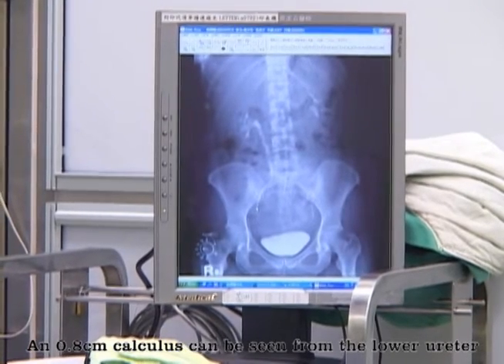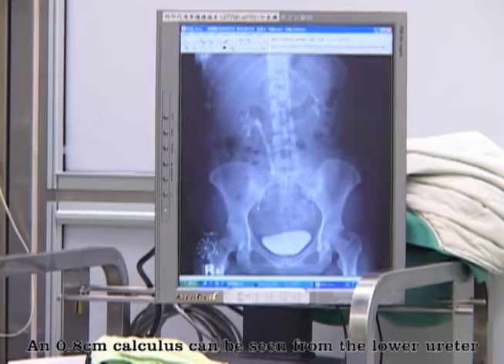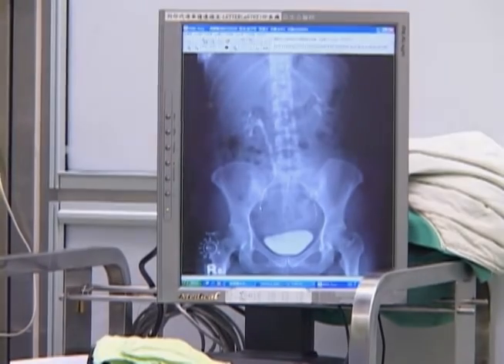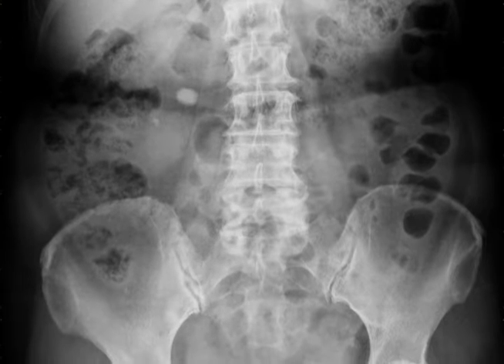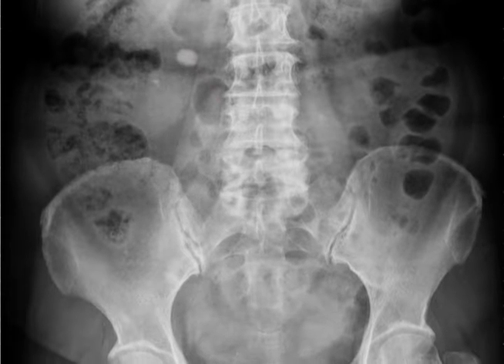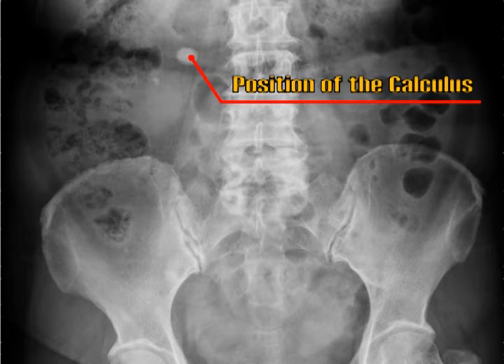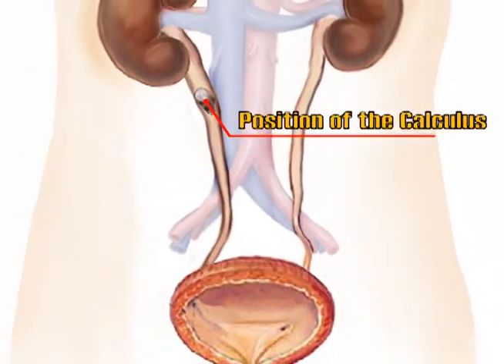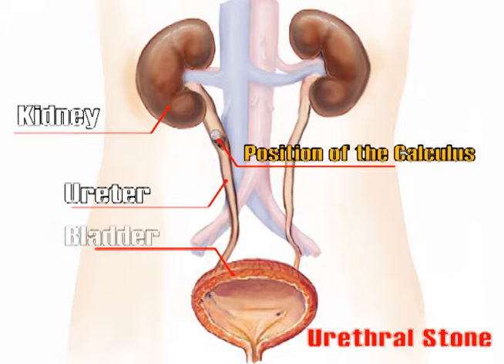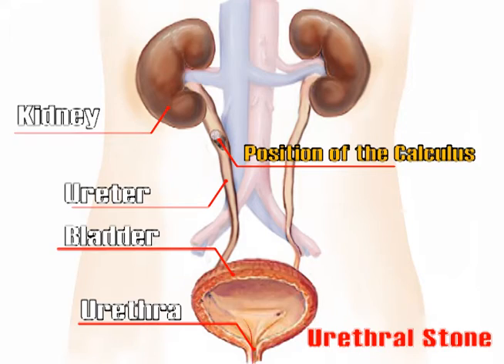A 0.8 cm calculus can be seen from the lower ureter.